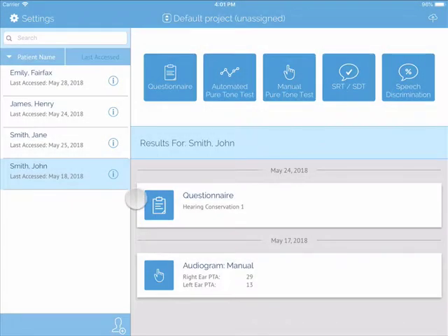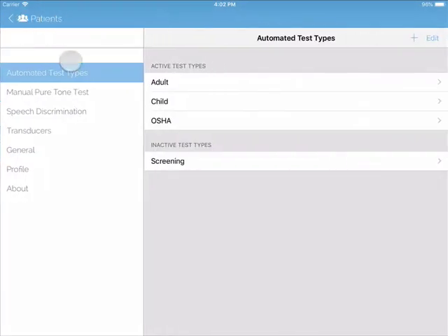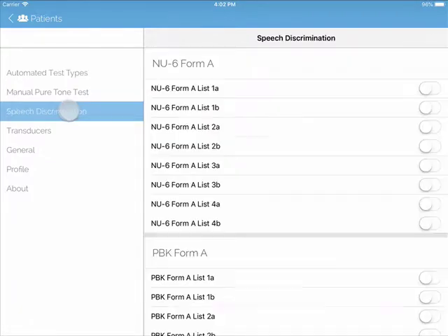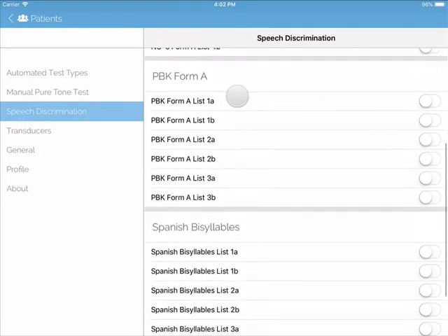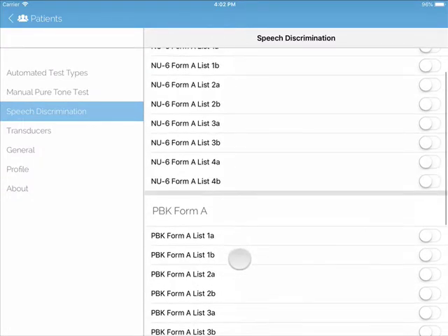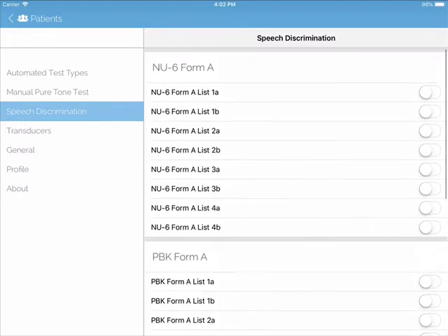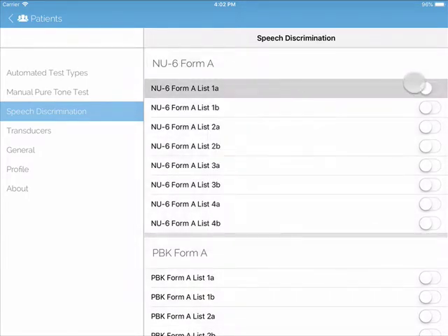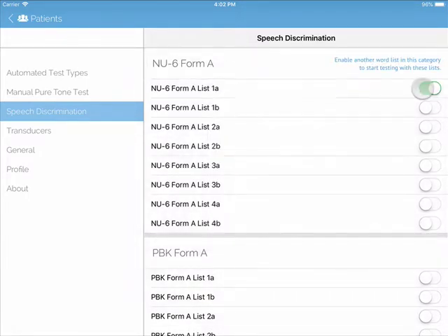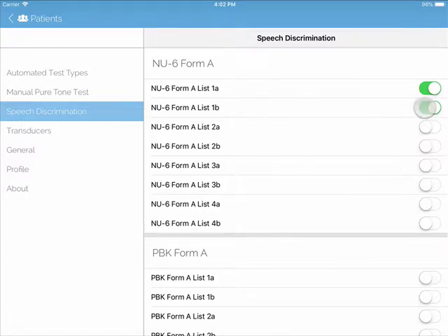To download your speech discrimination word lists, click on Settings and then Speech Discrimination. Speech discrimination lists included in Shoebox are NU-6 for adults, PBK for children, and a Spanish word list. Tap on the name of the word list to preview the words, then tap the toggle to download the list. Please note that this step does require Wi-Fi.